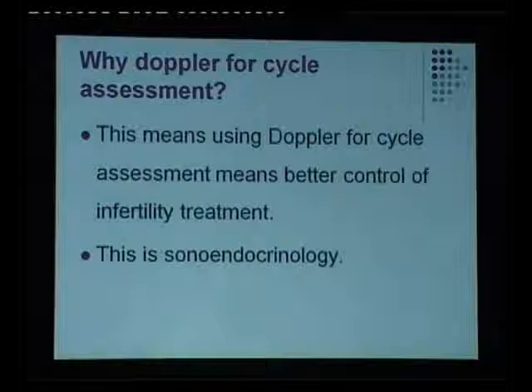In the same study that I mentioned in the endometrial presentation, we do the 3D power Doppler studies for the follicles also, and it has been shown that when the vascularity is good, when the VI is between 6 and 20 and FI is more than 35, the chances of conception are extremely high.